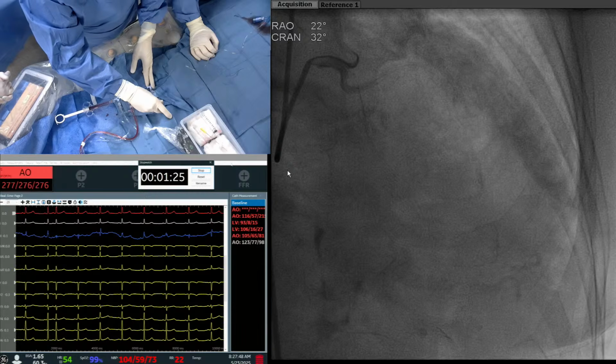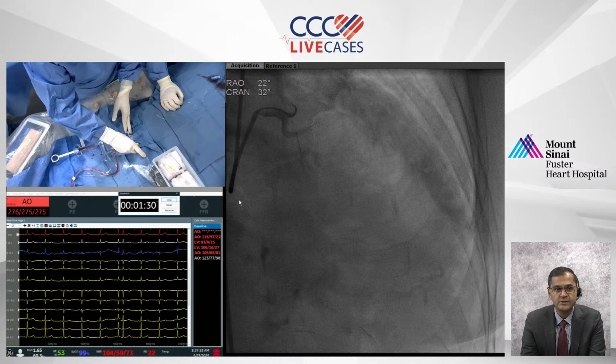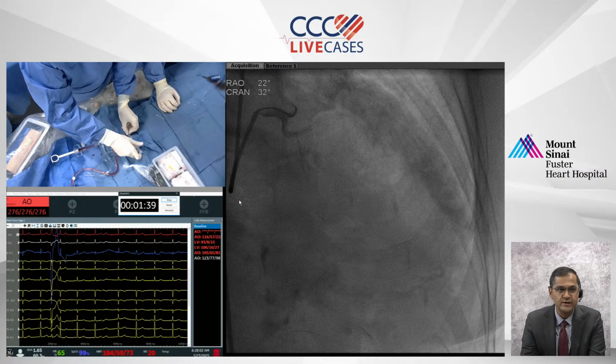Yeah, Pedro, I agree with that. And I think it's important that you stay, just like you said, on your A game, watching the EKG the whole time. And I had a case just this week that also spasmed at 20 micrograms. And so it's never a guarantee that this low dose isn't going to have an effect.